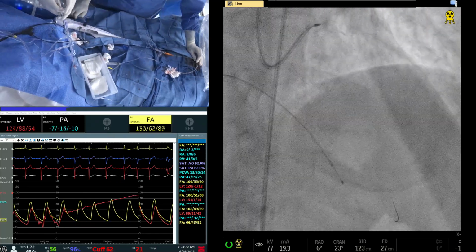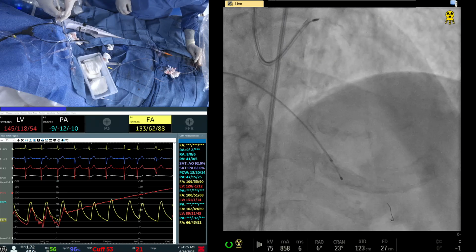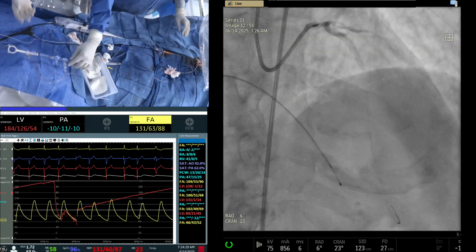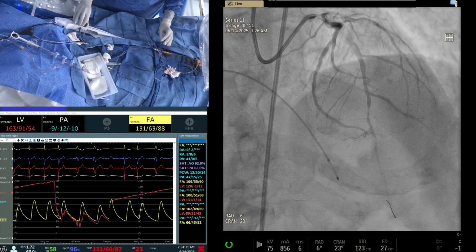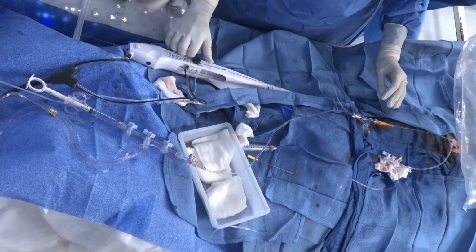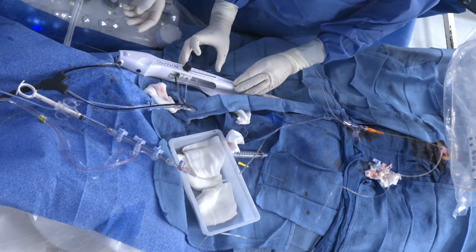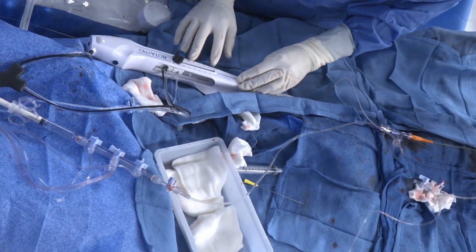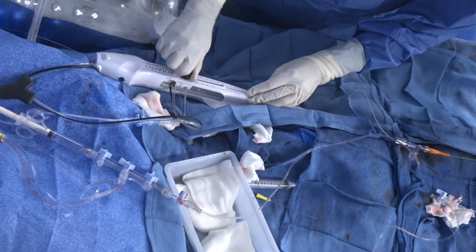Let's take one picture. So we have to go that far. Very complex. Okay, so we can show you how we can use DynaGlide and move forward. You get the Dyna button. You see this knob, this is about 9 centimeters, so you need that length to go there. So you tighten the knob.